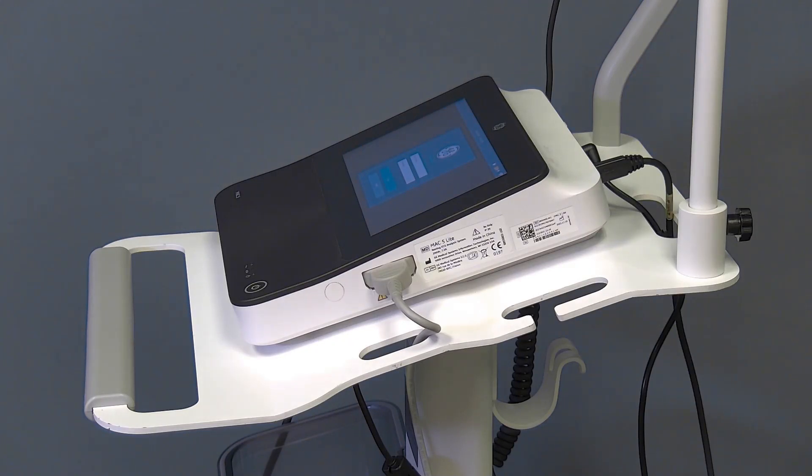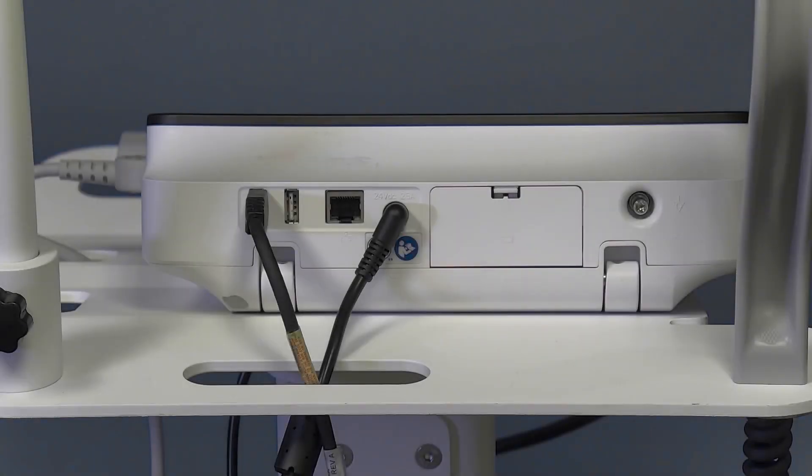Let's take a quick look at the external features of the device. The patient ECG cable is located on the right-hand side of the device, while the posterior of the device provides access to the two USB ports, the Ethernet port, the DC power inlet, battery door, and equal potential grounding plug. The left side of the device provides access to the printer door on the standard MAC-5 model. The MAC-5 Lite does not support printing.